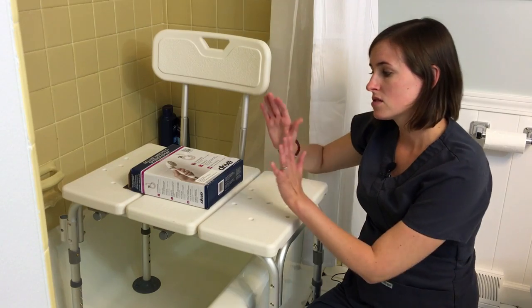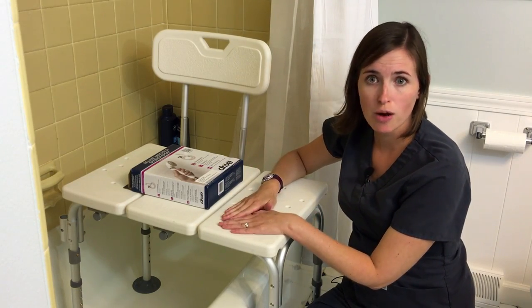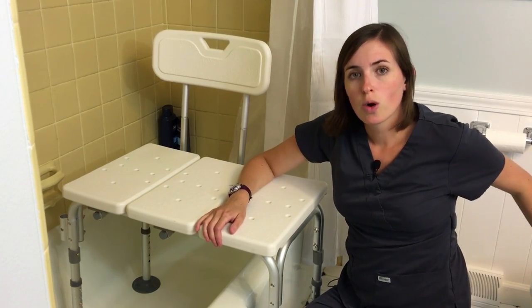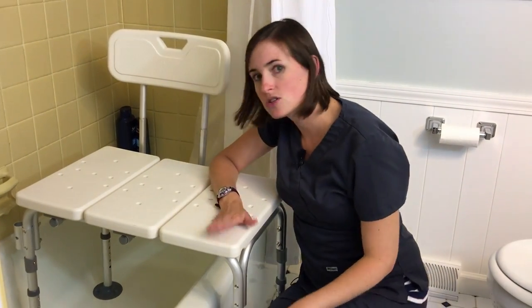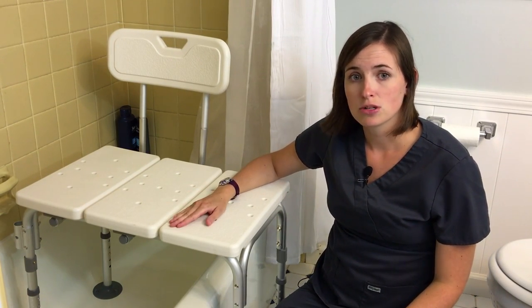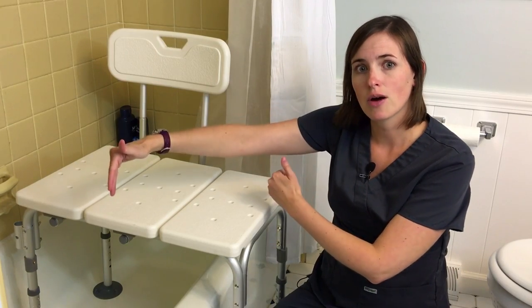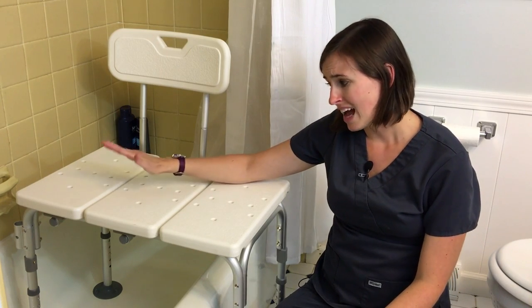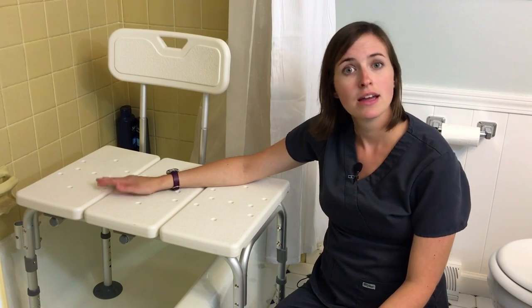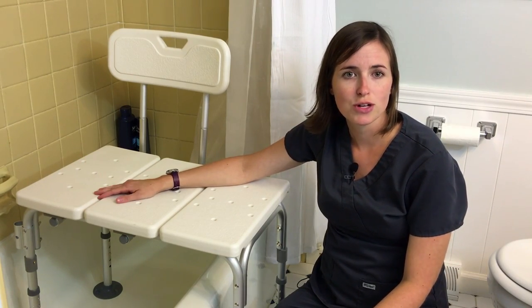The last thing I want to bring up is what you do when you're done with your shower. In this particular bathroom, you can see we have a toilet on the opposite side of the shower bench. Because these shower benches stick out a little bit, you need to consider the amount of space left. In long galley-style bathrooms, you may need to remove the shower bench between showers and place it in the shower so it's out of the way and not a trip hazard for somebody coming through to use the toilet. If you have any questions or comments, please feel free to leave them in our comments section and consider subscribing to our YouTube channel. Thank you.